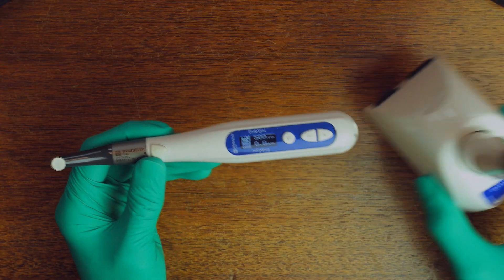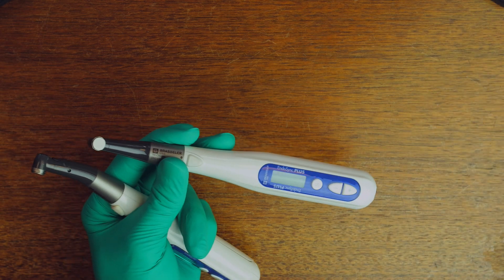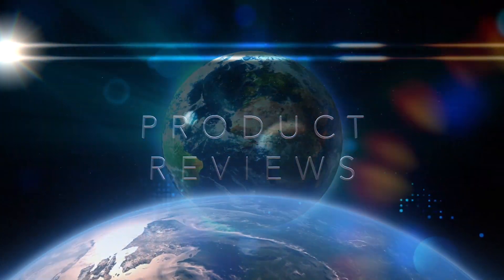Recently, the Endosync was updated to Endosync Plus, which physically looks identical to the Endosync, but packs a couple of new features which I want to talk to you about in this video. I know that everyone is super busy, so let me get straight to the point and show you the main features of the Endosync Plus before we get into this video.